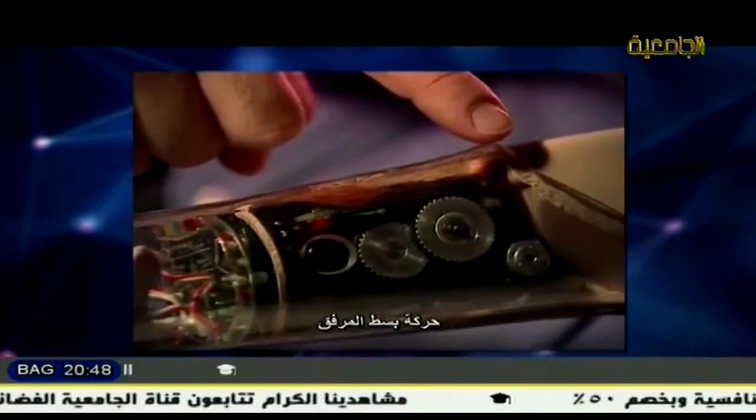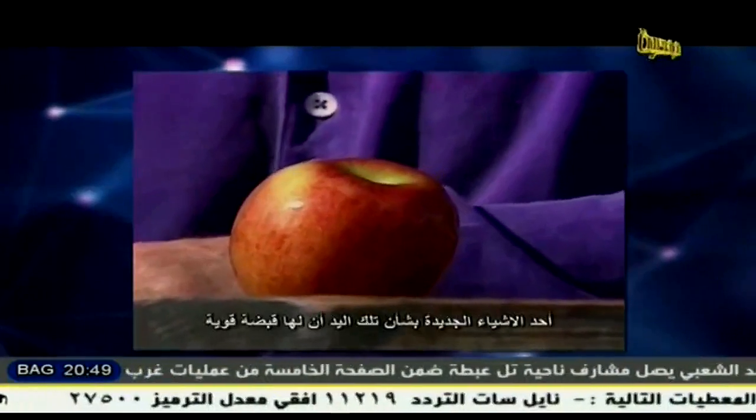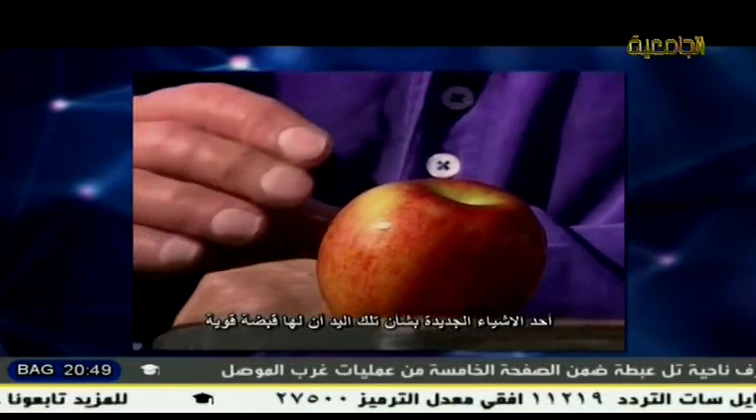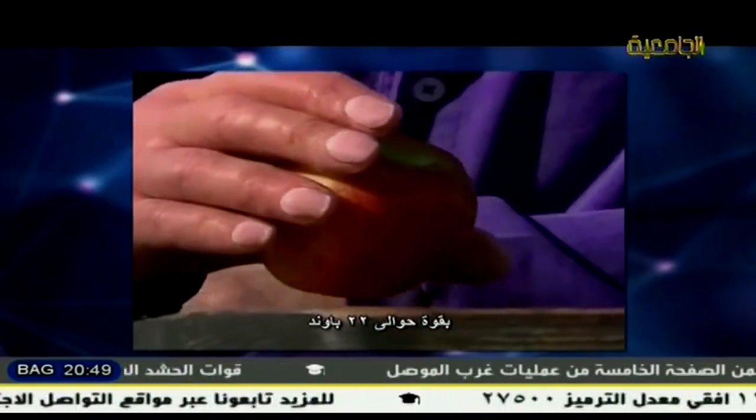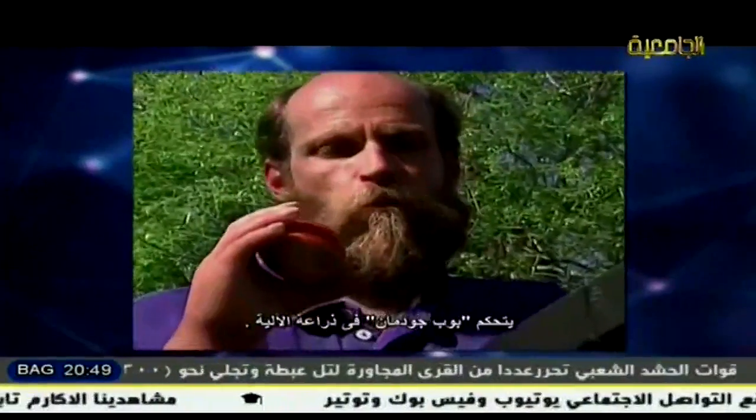We start off with a silicone skin, and inside it there are electrical motors that control the opening and closing of the fingers. Next, very often we have an electrical motor here that operates wrist rotation, supination or pronation. Then we also have an electrical motor over here that controls this transmission that you can see, that controls flexion and extension of the elbow. The microcomputer is mounted right here, and that processes all that information.